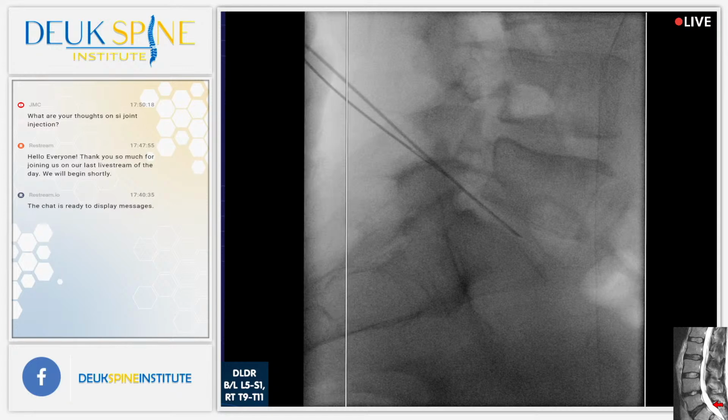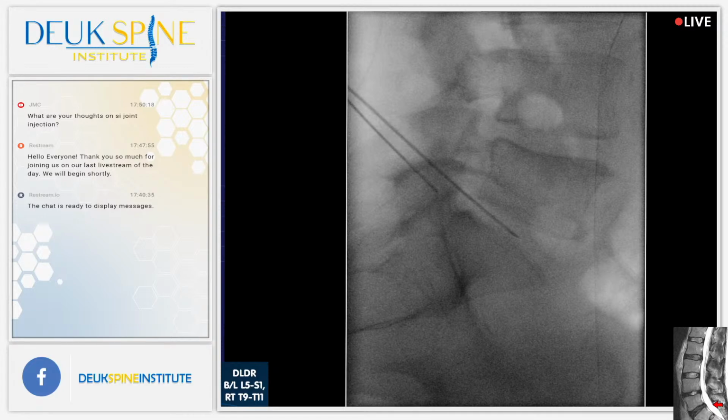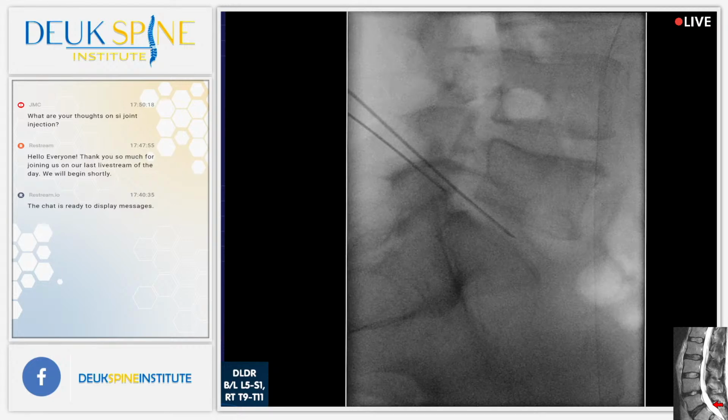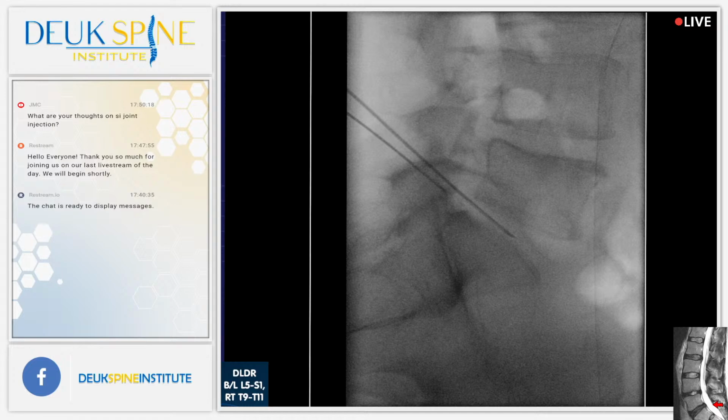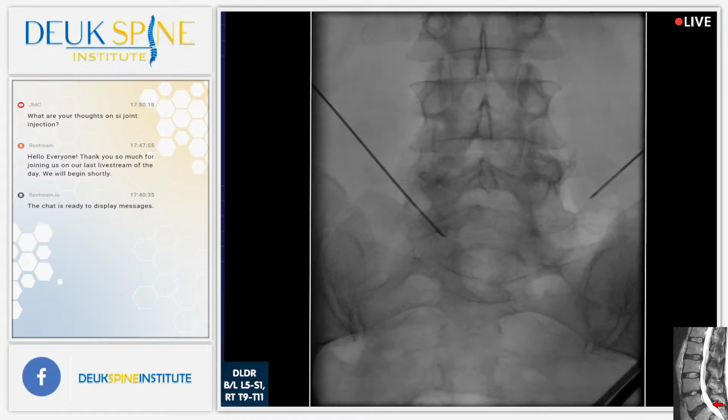I mean, it does and doesn't. The fact that he has a segmentation anomaly, lots of people do. But having trouble getting in is not normal. I have lots of people with segmentation anomalies from birth, but I get in all the time. It's no problem. His, for some reason, is making it very challenging to get in. I think his spine is anterior too. I need to be more medial.